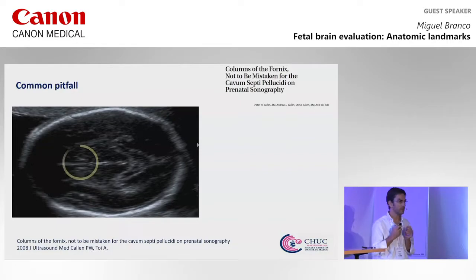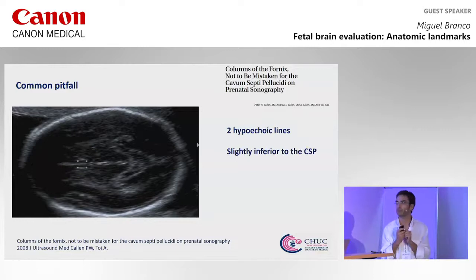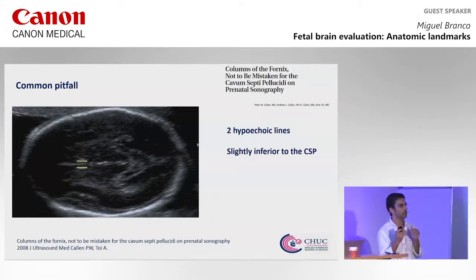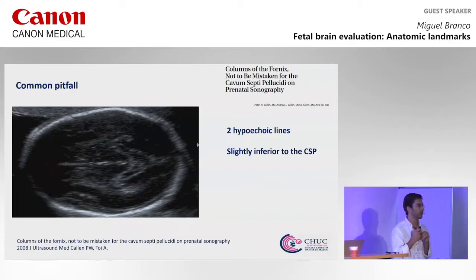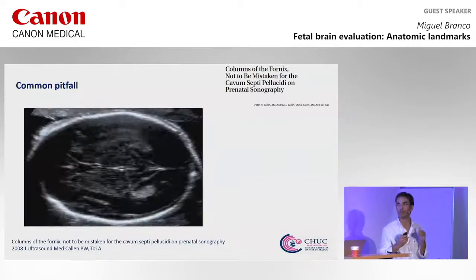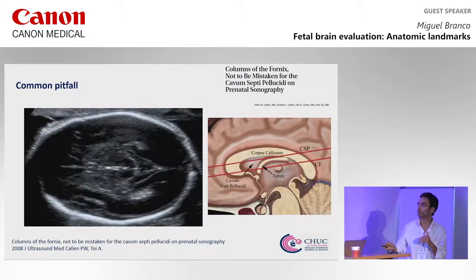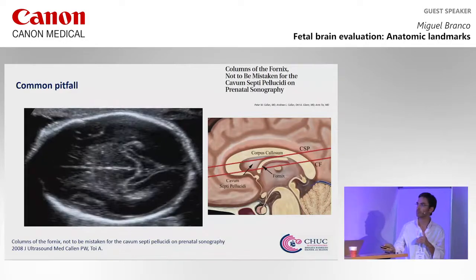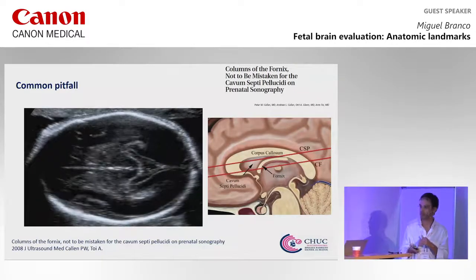There is a common pitfall: mistaking the columns of the fornix for the CSP. The columns of the fornix are two hypoechoic lines without fluid inside and they don't interrupt the interhemispheric fissure. In reality they are a little bit below the level of the cavum septum pellucidum. Here you can see the columns and the cavum.